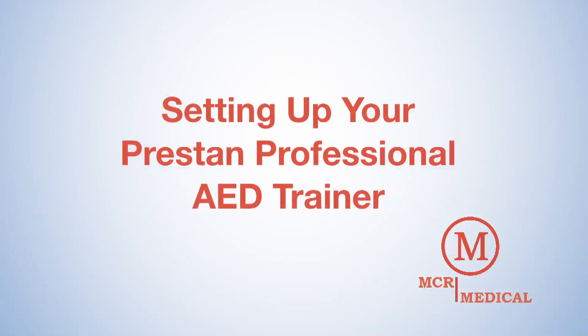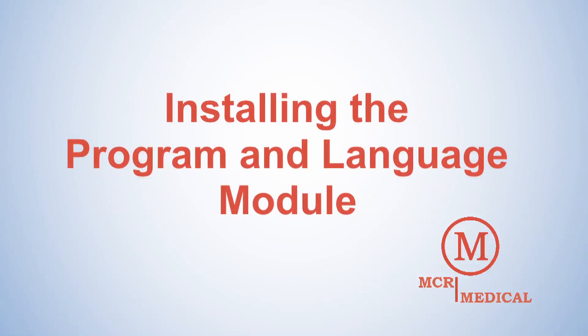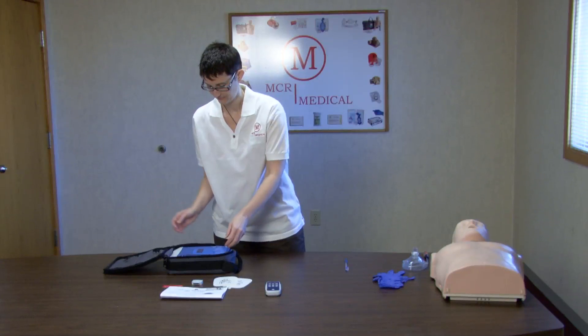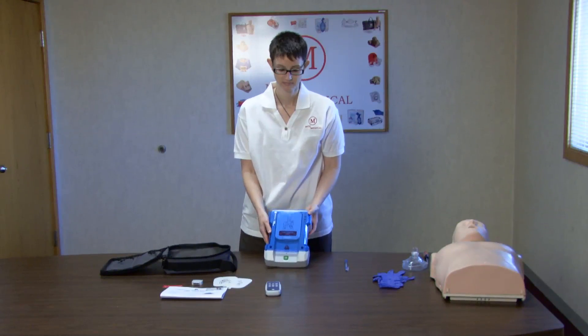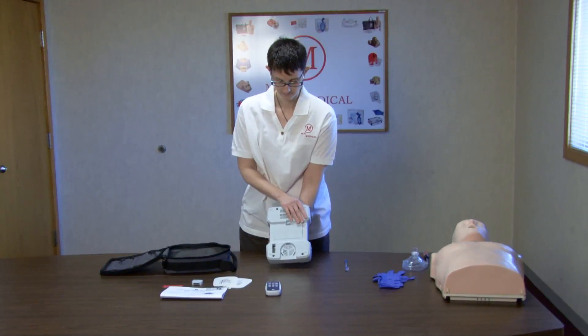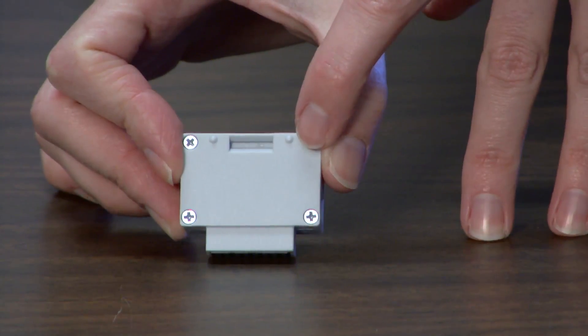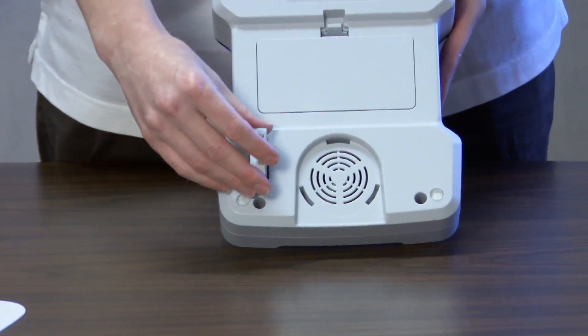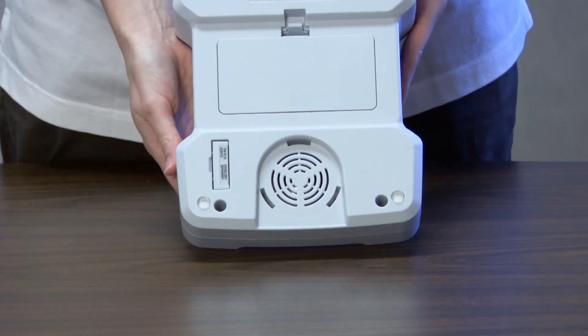How to set up your Preston Professional AED Trainer. First, we'll be installing the program and language module. Remove the Preston Professional AED Trainer from the carrying case. Lining up the notches to ensure proper installation, insert the module into the back of the unit on the lower left-hand corner by pressing firmly. When ECC guidelines change, simply replace this module.